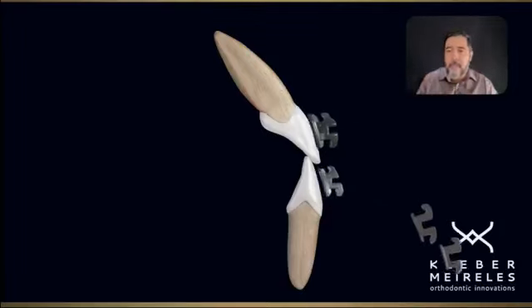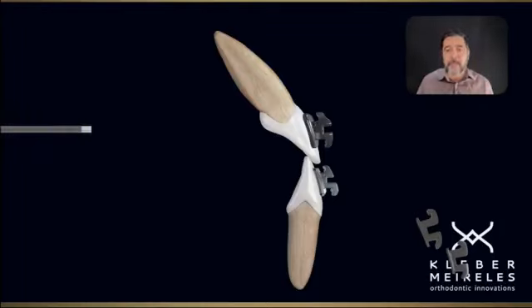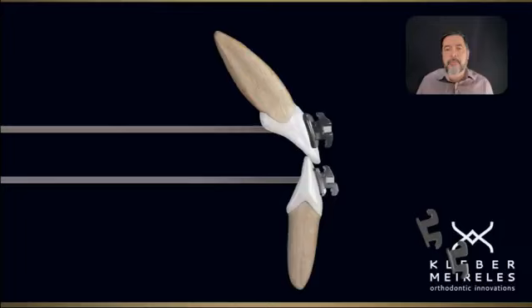What is going to happen now? So yes, I'm changing the bracket, so I don't need to think about it. Yes, it's a good thinking, but let's see some variables here. Well, if we have the finishing steps of our mechanics, this situation will be probably good for you because you're keeping the inclination of upper and lower in average. Let's say 20 degrees or something like that in upper arch, minus 10, minus 15, I don't know what is the prescription that you're using, but it will keep the inclination.